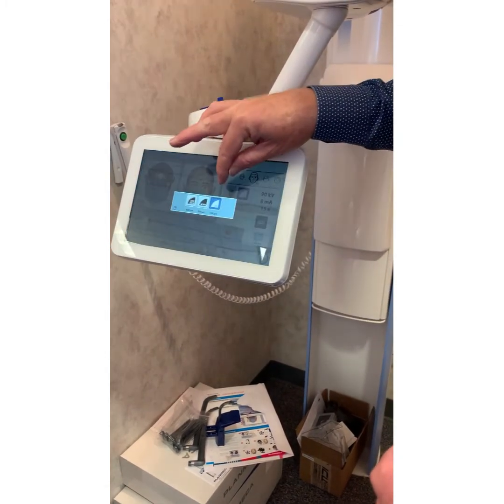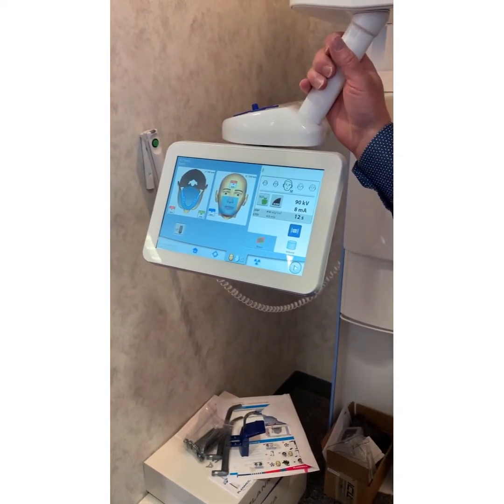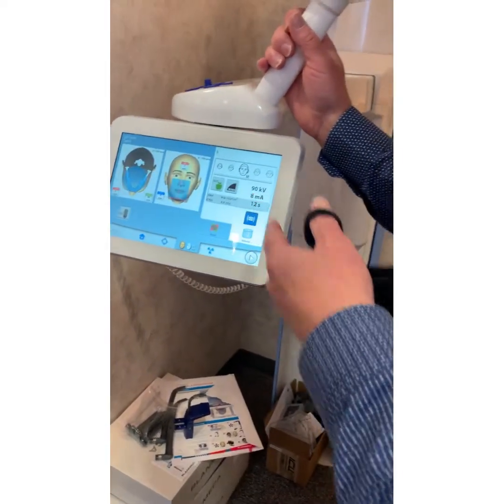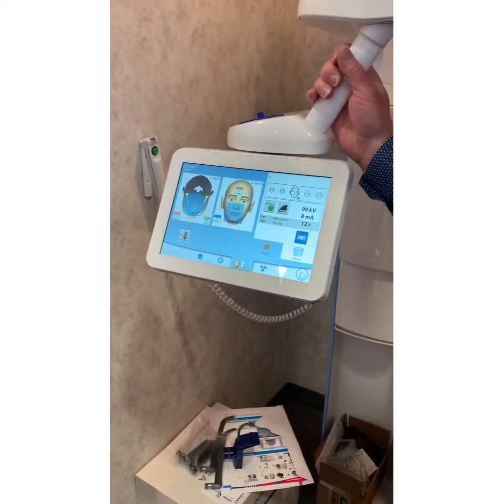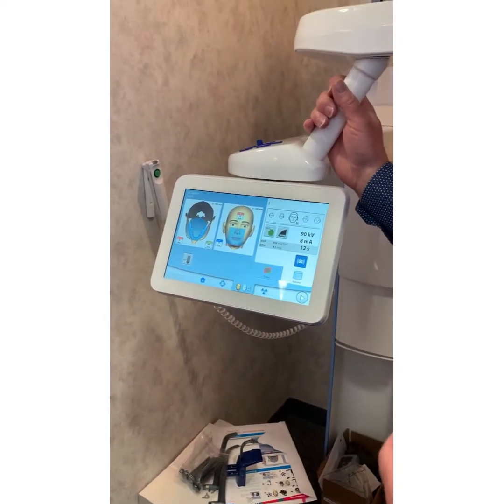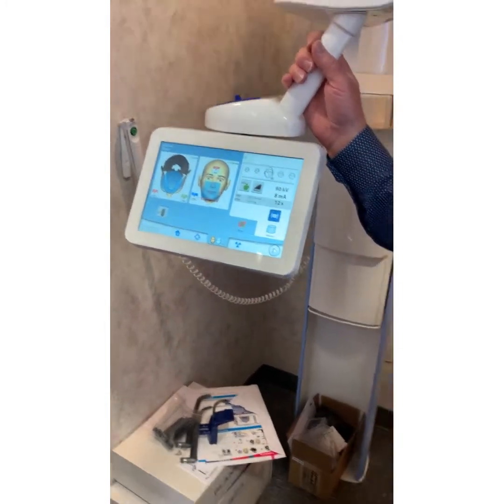However, I've been wearing these contacts for 4 years. I can totally pop them out and drive back down to San Diego totally safely. But I'm so used to seeing everything sharp that I'm spoiled. I wear my contacts every day. So if you take it at high definition all the time, and then one day you accidentally go back to normal, he's going to look at it and go, "What's wrong with that one? There's something wrong with that." Let me ask you this: can I still see fourth canals and a root canal with regular definition? Absolutely. That's right. All right, that's fine.